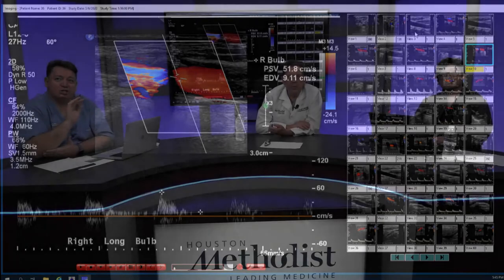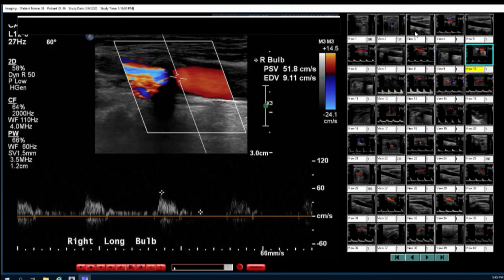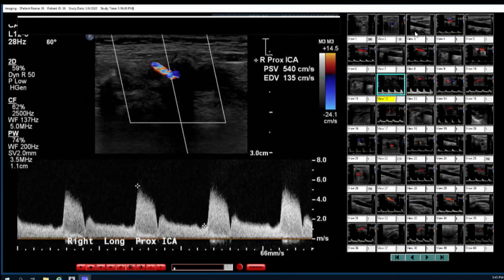Now go back and show that this is acoustic shadow again. This is what you want to see. That's a beautiful calcified plaque. In the past, we had the history of not scanning or not measuring velocity underneath, but you can find a different angle where you can see velocity even under the calcified shadowing. That's a very good example of what you would miss. You see the aliasing: the flow coming in has no flow disturbance, but the flow coming out has a huge flow disturbance, and the color tells you there's increased velocity.